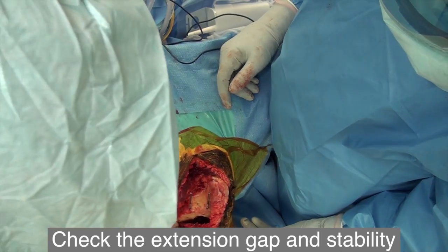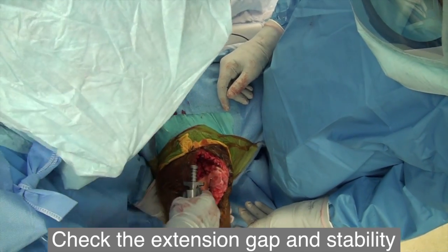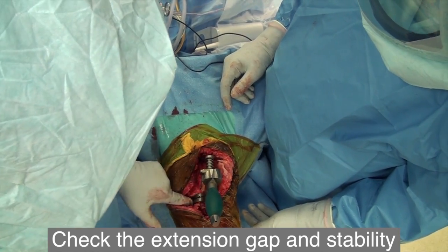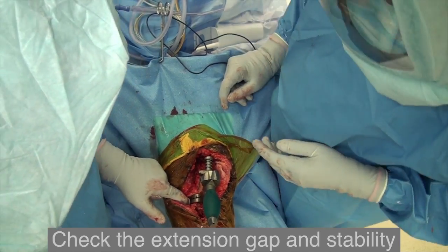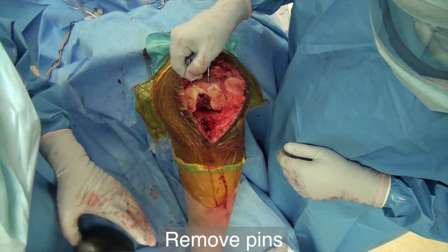Extend the knee and check the gap. Check the medial-lateral stability and make sure that you get a full extension. Recheck with different sizes to establish the best fit. If the cut is sufficient, you can remove the remaining pins.